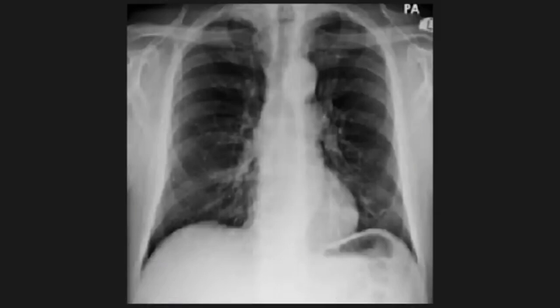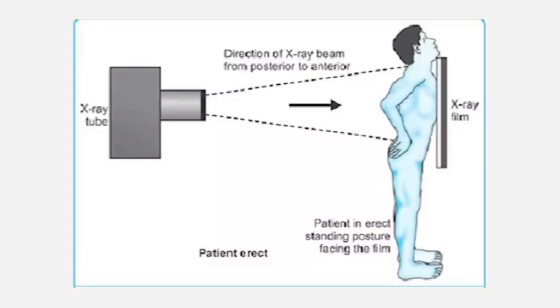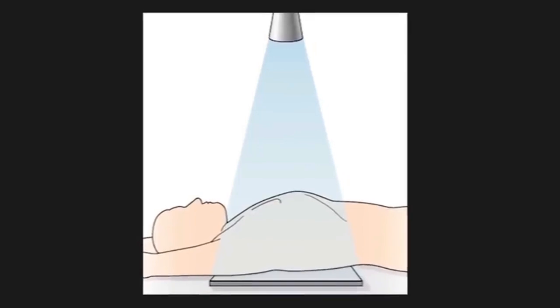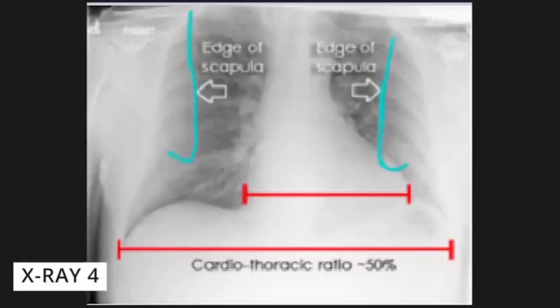It is. Think of shadow puppets. Okay, shadow puppets. If your hand is close to the wall, the shadow is crisp and accurate. That's a PA view, which is the standard. PA meaning the beam hits your back. Right, the beam hits your back and your heart is close to the film at the front. But in the ICU, patients often can't stand up for that. So the beam comes from the front. That's AP. Now the heart is farther away from the detector behind their back.